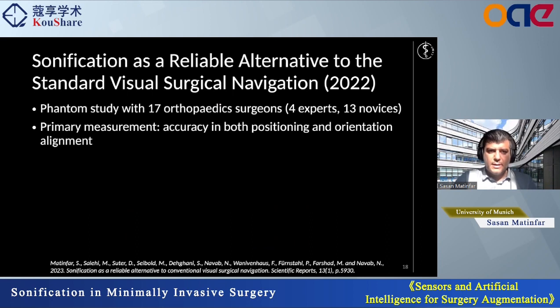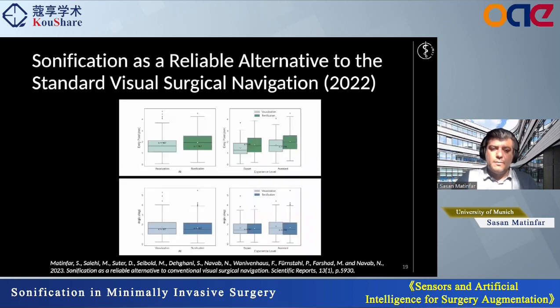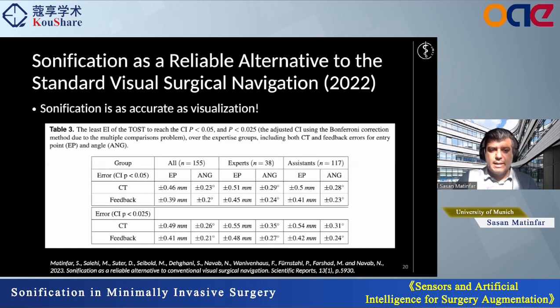So we conducted a user study for pedicle screw placement tasks on phantoms with 17 orthopedic surgeons, and our primary measurement was the accuracy of positioning and orientation alignment. Our results have demonstrated that sonification can be used accurately, similar to visualization, as we compared our system against a standard visual navigation system. And we showed that our system can accurately support surgeons in terms of alignment.